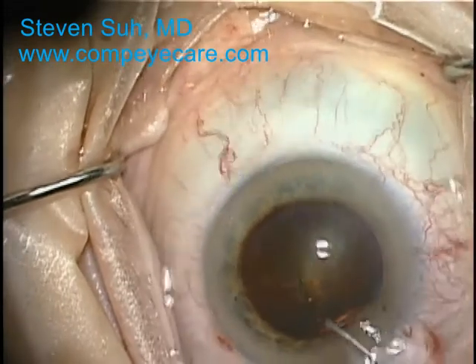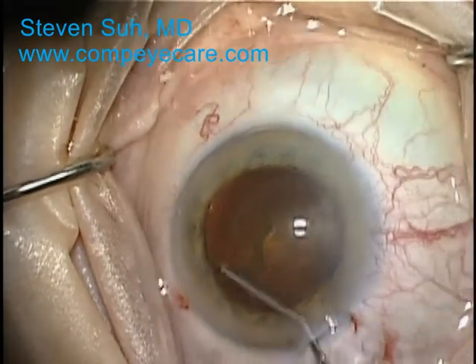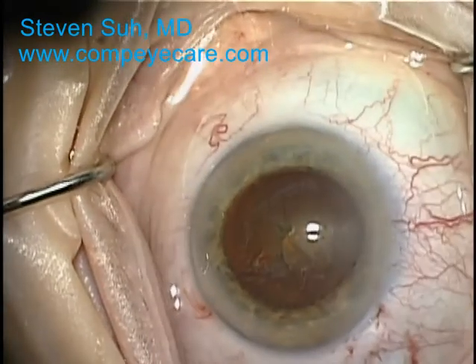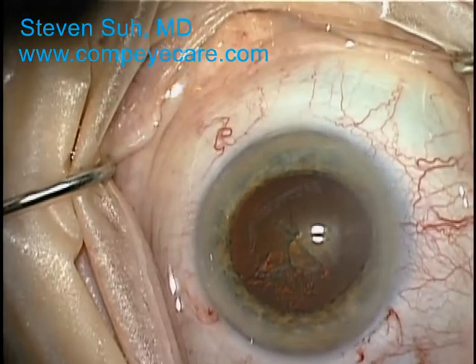Next, I use a syringe with a cannula to inject a special saline solution that loosens up the cloudy lens material from the capsule. This will enable the cataractous lens to rotate more freely in the capsular bag.